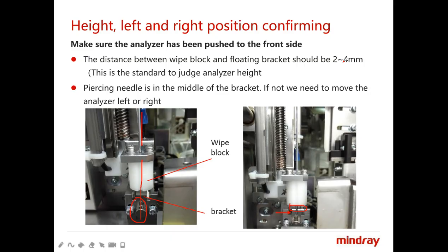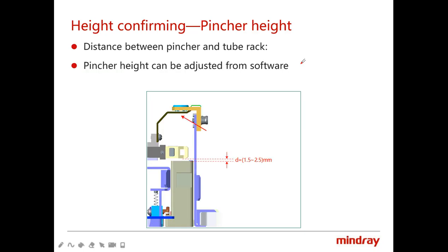If it's not suitable, you need to adjust the foot of the analyzer to raise it or make it lower. Is it clear? It's quite easy. Yeah, that's clear.